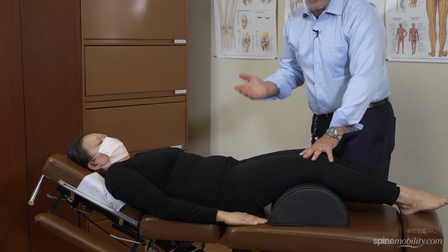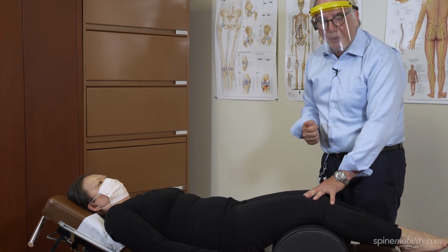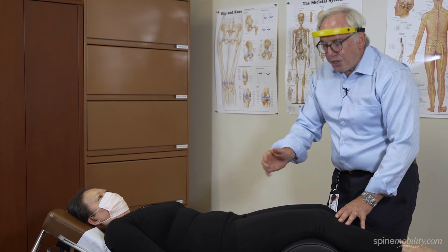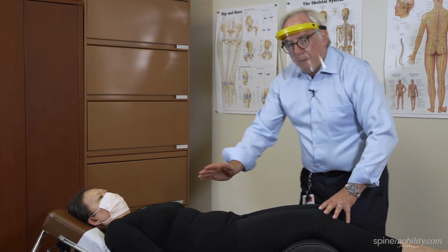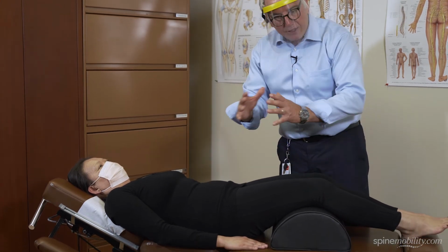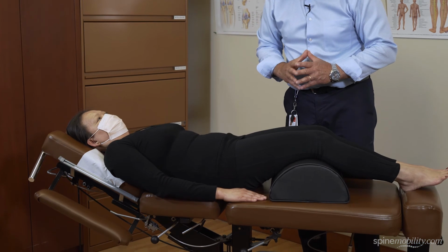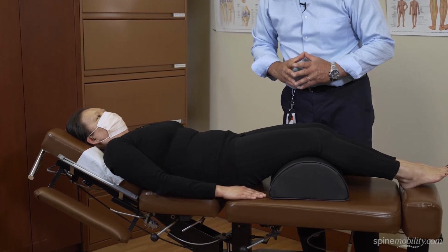the various maneuvers in the supine position include neuromobilization and stretching of the glutes and the erector spinae, but the patient is in a flexed position. The lumbar lordosis is reduced because the patient's in a flexed position, so that maximizes the opening of the spinal canals, particularly in patients who have the radicular form or the mixed type of spinal stenosis.